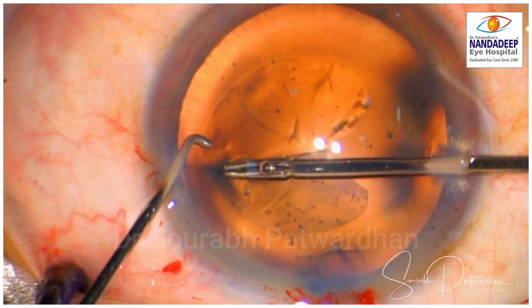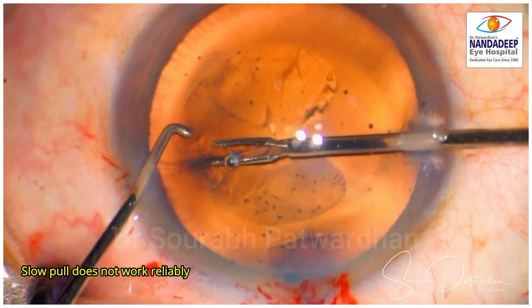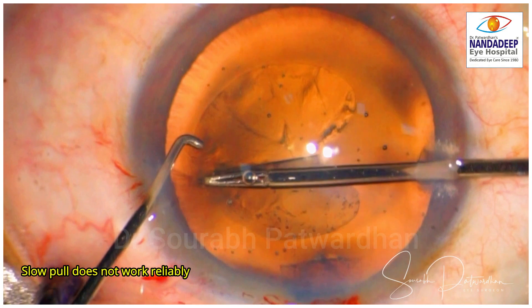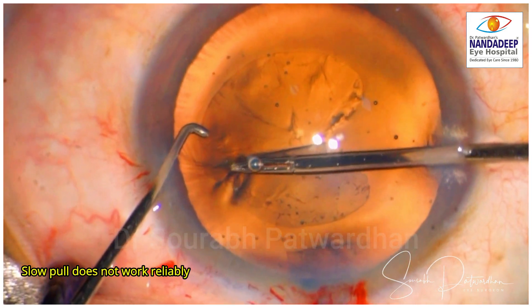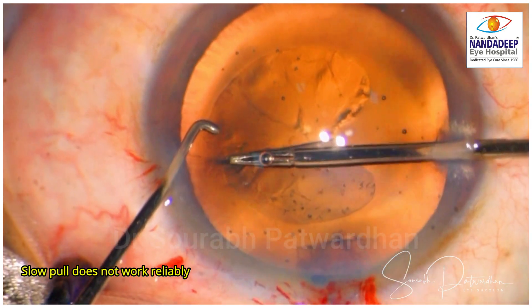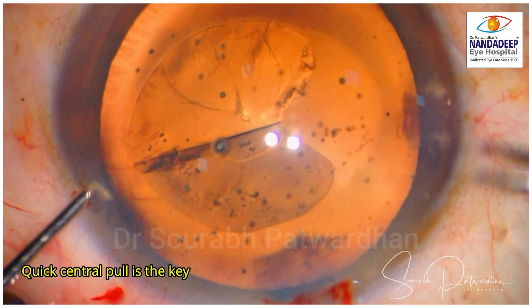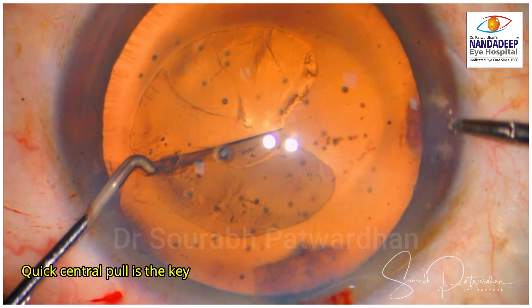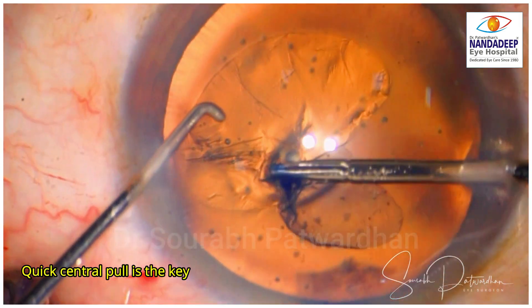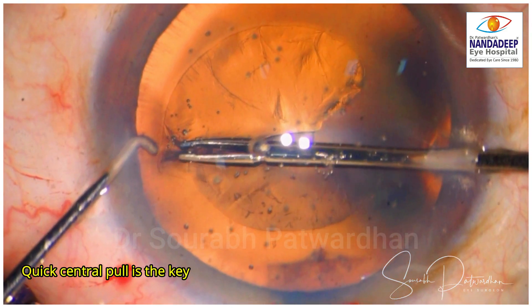In this technique it's not just the centripetal pull, but also how quickly you pull — that is very important. Here the surgeon is trying to slowly pull the extending tear inside but is failing. The reason is that the tractional pull of the zonule is still higher. To negate that, one must pull it quickly and centripetally like this.